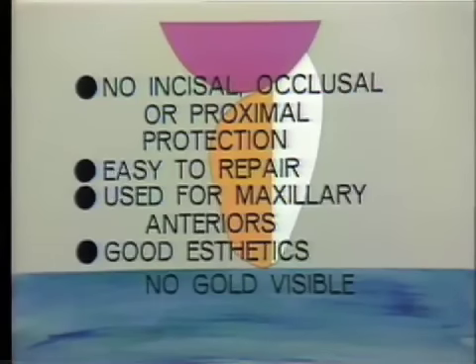Because of the problems of occlusal protection and the difficulty of obtaining this, they tend these days to be used mainly in the maxillary anteriors, where they have the great advantage of showing almost no gold at all, and therefore produce extremely good aesthetics, which is very acceptable in that situation.